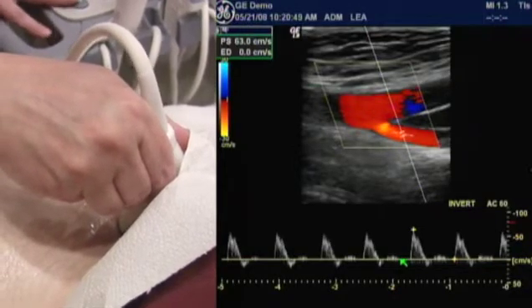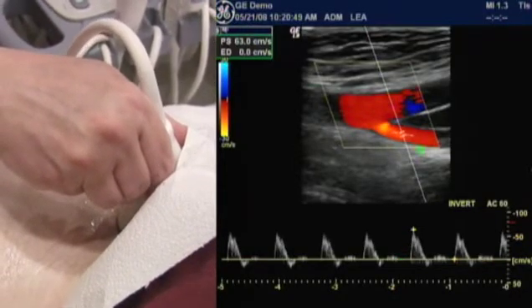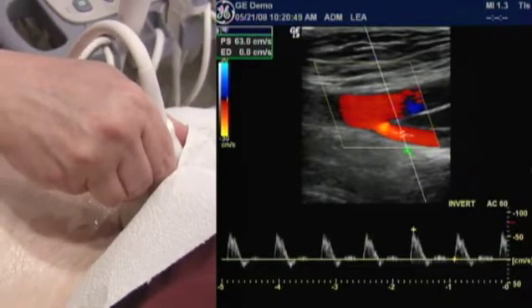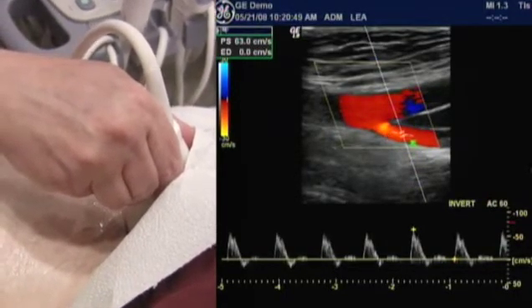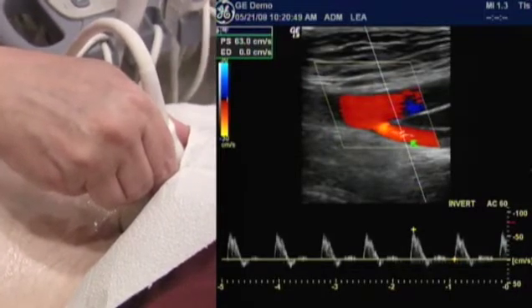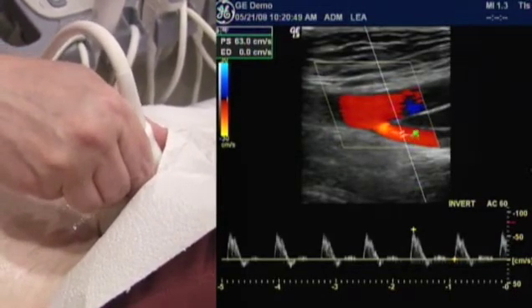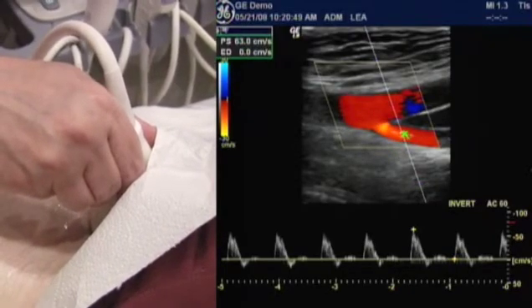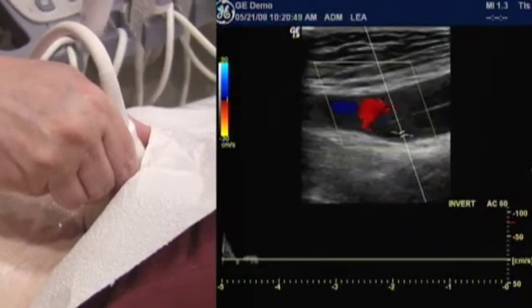arterial bed. This is probably the only area that we really need to look at for the profundifemoral or deep femoral. Basically just the origin, just to look at plaque. If there was disease, perhaps in the SFA, the profundifemoral artery might be a choice for a bypass inflow site.